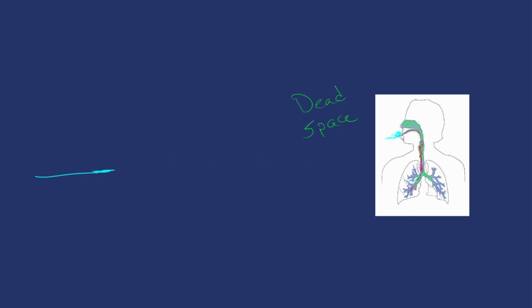As this starts to get up here, as it's trickled its way over, then we start to see the increase, as we measure here, of the CO2 that's being expelled by the lungs. Because as it reaches here, now that level is going to slowly go up as those gases have exchanged. And then it's going to get to a point where it about levels out. So the level that we had down here has finally mixed with all this and made its way out. So the level change here isn't going to be much different. It's going to stay at that same level. And then it's going to get to a point where it kind of peaks out.